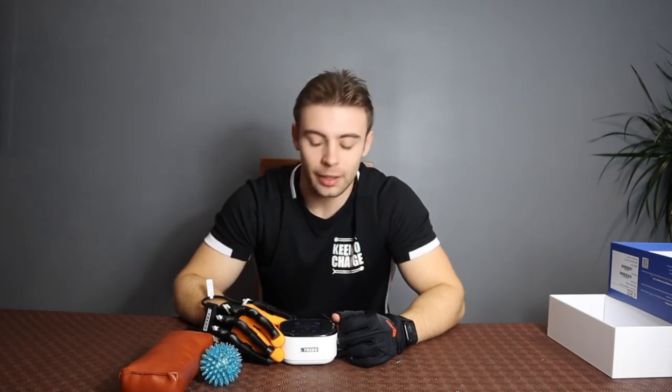There are specific modes on this device, one being manual training and the other being mirror training. Manual training is really great as it allows you to get your proprioception back and get the feel of moving your hand again. With mirror training, if I move this hand, this hand will also simultaneously draw itself in, and if I release it'll come straight back — we'll give you a proper demonstration just now.